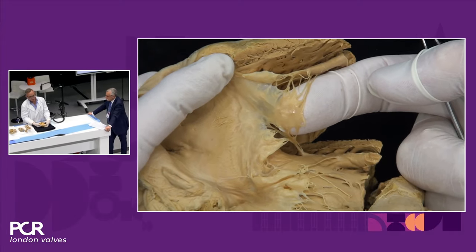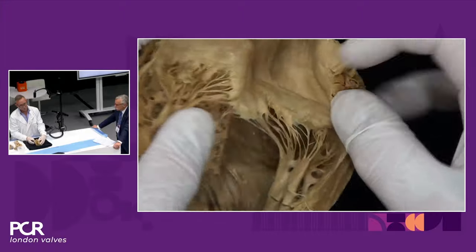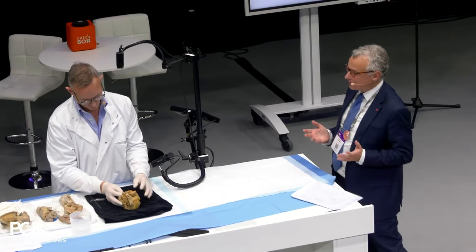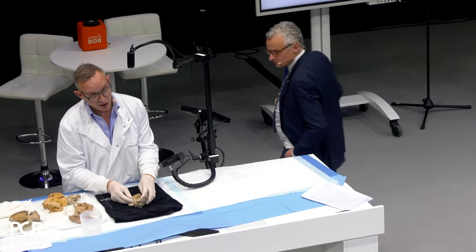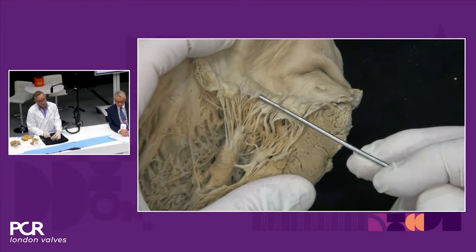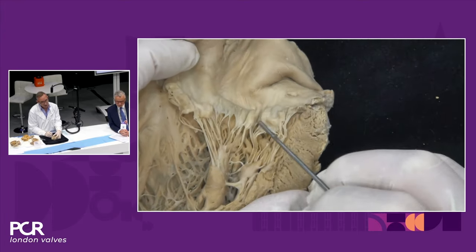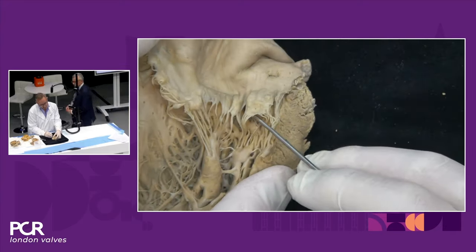So in a case like the one we have seen, which is mainly posterior leaflet tethering, the question will be where to grasp again, because in principle MR comes from the P2, P3 region, and this is a challenging area because of the chordal distribution. Yeah, and as I was showing you, chordal distribution, and then also the potential for the clefts that we are looking at. So opening up this other heart, you can see here's the anterior leaflet. This would then be P3, and this would be P2. And can you see there, in between those hoods, you've got potentially a cleft, if you look at that from above. Yeah. I wouldn't call that a cleft myself. It's an accentuated fold, effectively.